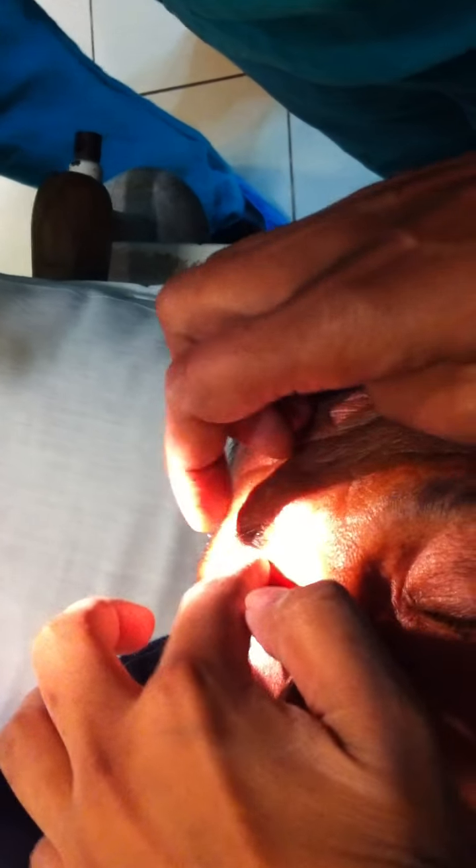Watch out. Don't touch it — take the globe and press there. So the point of injection is the lateral one-third only. You will go in this direction, so this becomes the lateral one-third junction.